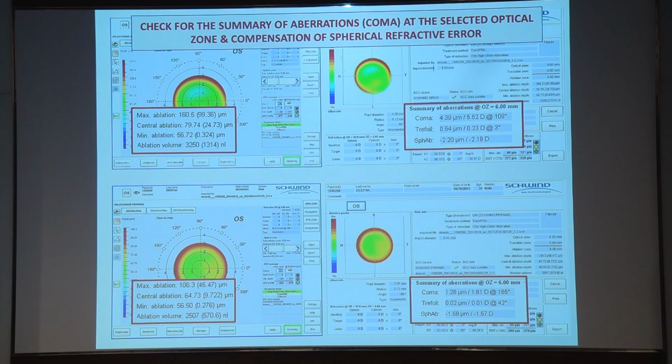with the patient close to 40, about 35, don't worry about this because the lens has stopped accommodating. He's going to stop accommodating. So only stick to this one. So you have to understand that as you grow older, focus more on only the cornea as your main, even though it's burning a little more, you choose how much to correct, but use this because here it will not work since the lens is not accommodating anymore. So it works for normal as well as irregular corneas.